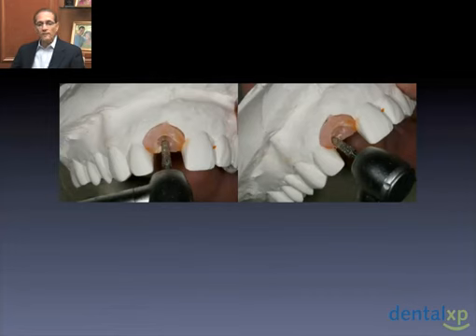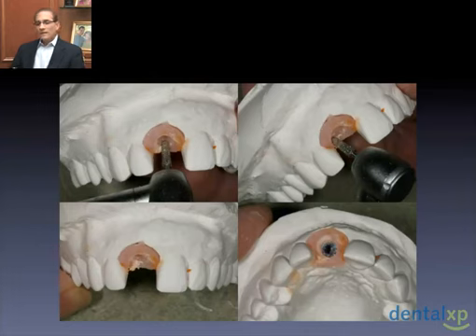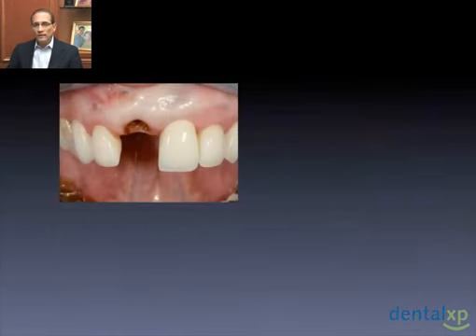I'm going to continue in shape and contour and widen it and open it and see what I end up as my final shape. Now, at this stage, after I've seen what I've created here, I may elect to go back to the patient's mouth and do some more lasering and opening the contours, or I may just elect, because I've contoured it some with the laser and I'm halfway there, to not do any more sculpting chairside, create the provisional here, and then allow the pressure and the placement of the provisional to continue to guide the tissue.